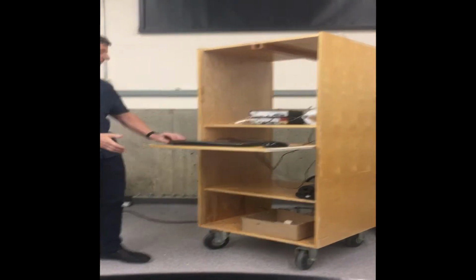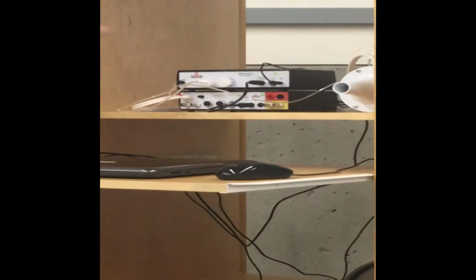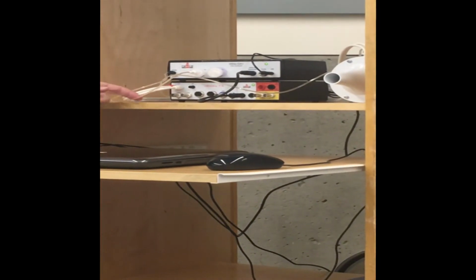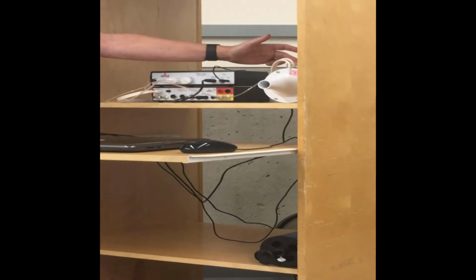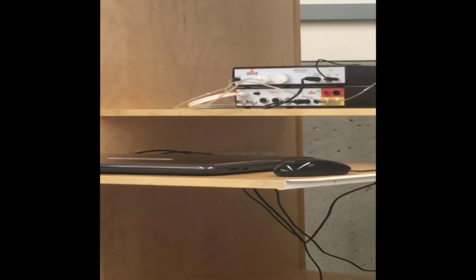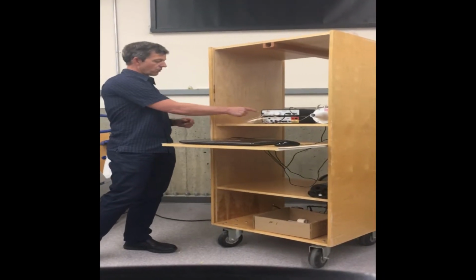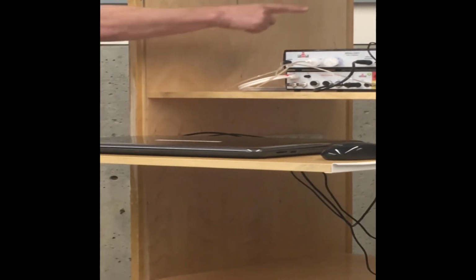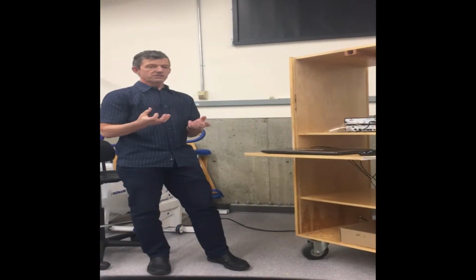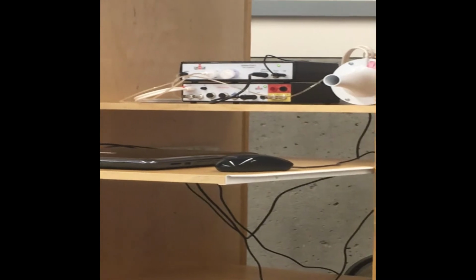If we look at our two modules that we're using, this is our gas analyzer that's on the top, and we have a cable that's coming in from the heart rate sensor. The sample line comes from the front of the mixing box, so the air is sampled from there, and it's then going into it. And this is also a closed system. We don't want to lose any air. So instead of just having the air go out an outlet, the air goes back into the mixing chamber. The key thing about this system is we don't want to lose any air. All of the air that the subject is breathing out, we want it going through the system, and we want it going through the flow meter.